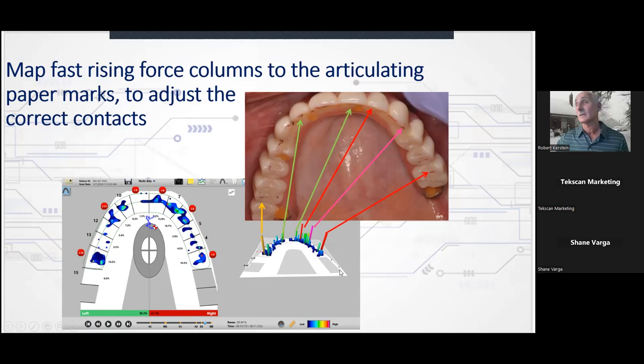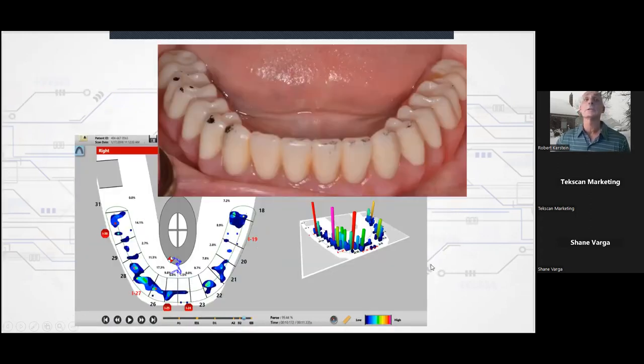You remark the teeth and you map the contacts until you adjust it down to balance. This is an interesting comparison. This is the lower provisional, and looking at these contacts, this gives you some orientation. Notice this is not all the way to the distal, and it's more to the buccal. There's all the way to the distal where the mouse is. That's this area, and the lingual area is this area where the mouse is. Next one, more mesial, right?